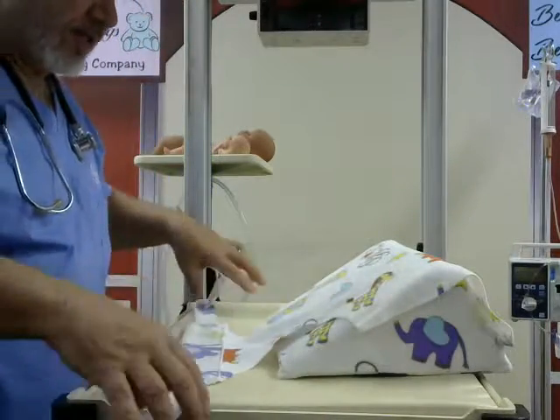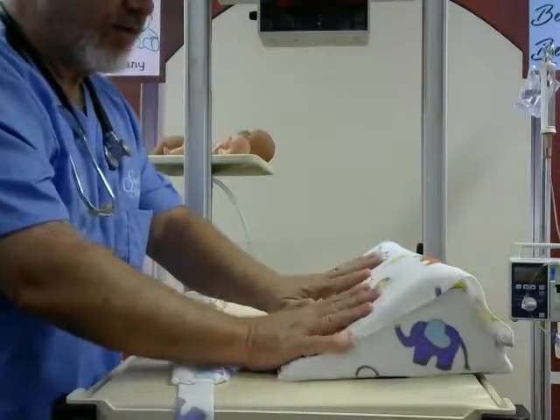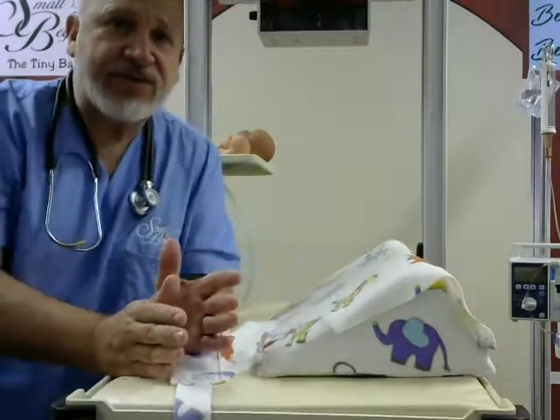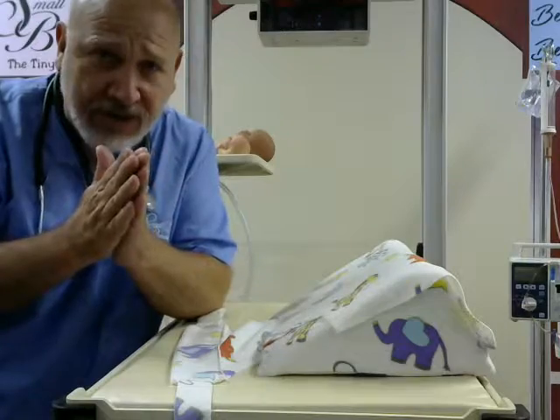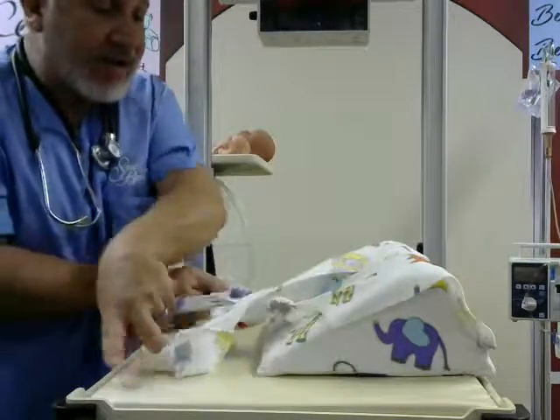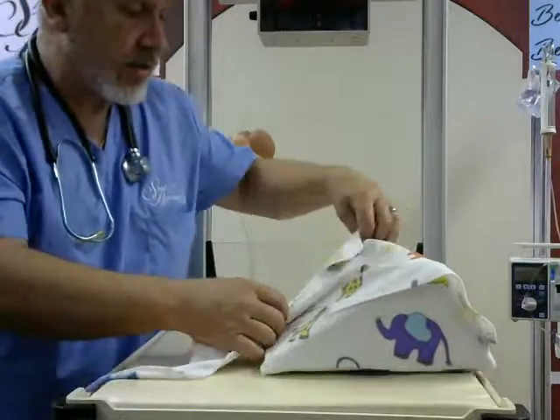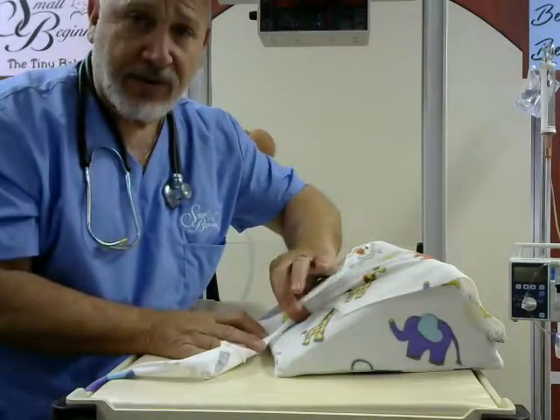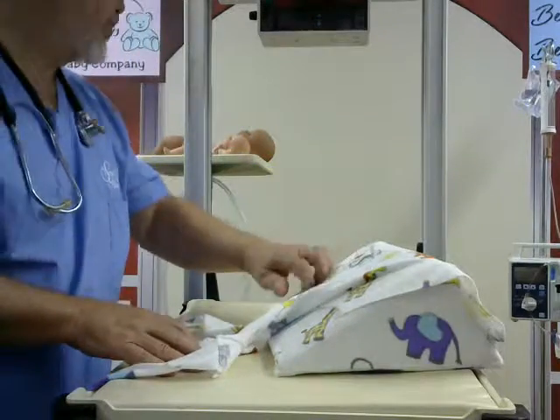The harness is ready to go for the baby. But because we're dealing with a micro-preemie, we want to use a narrower crotch for the infant. So what we do is simply take the device and twist it once, like so. What that does is it reduces this area right here for the preemie.